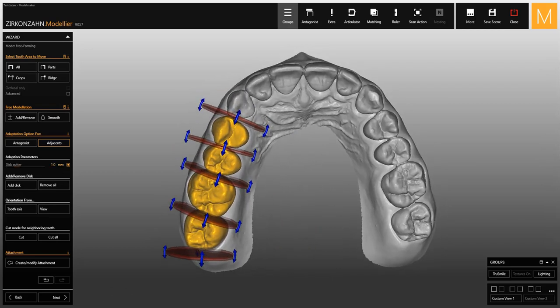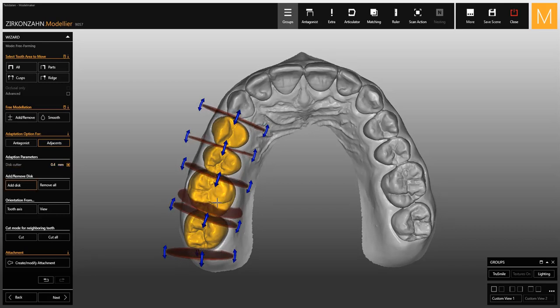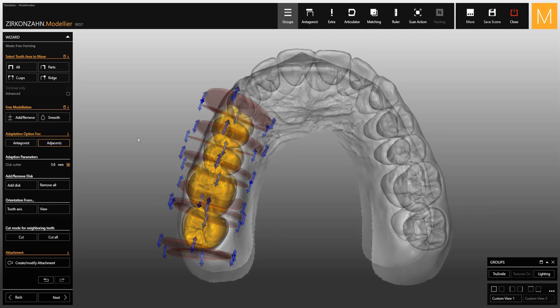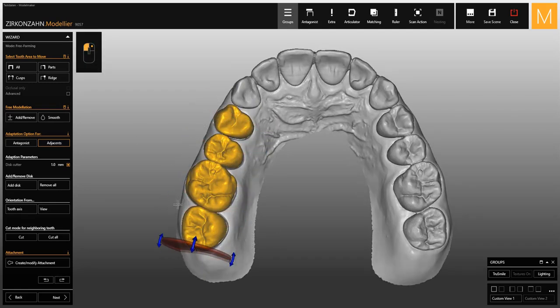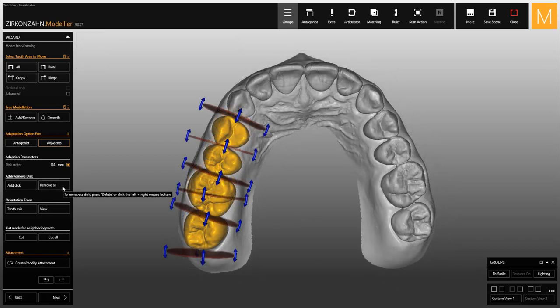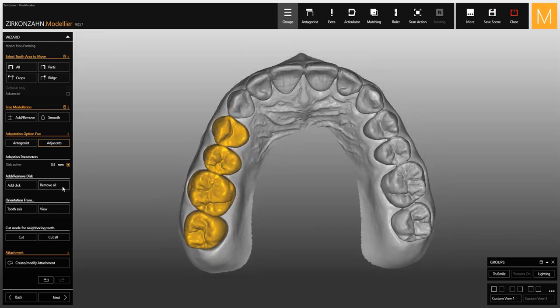With this slider you can change the thickness of the disks. When selecting 'Add Disk', a new disk is added. To remove it, right-click while holding down the left mouse button. If you select 'Remove All', all disks are deleted.